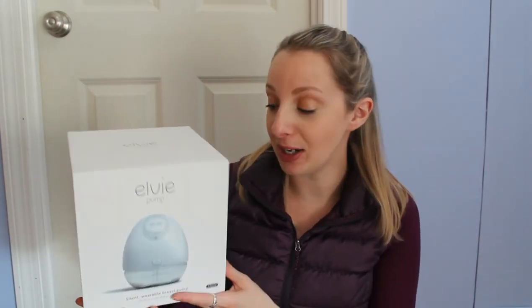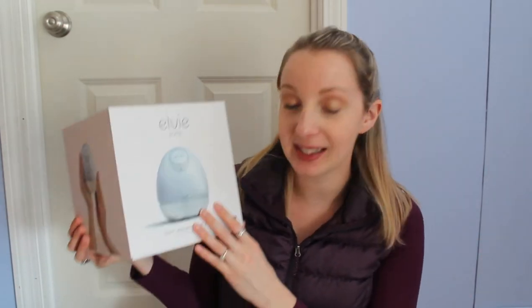It is wearable, silent, hassle-free, and smart, so it does connect to your phone, which is awesome. I will link everything down below. I'm going to unbox this with you — I haven't opened this. After I unbox this, I'm going to try this out and give you guys a full review. If I really like it, I'm thinking of purchasing the other one, but I wanted to see how I liked it first.